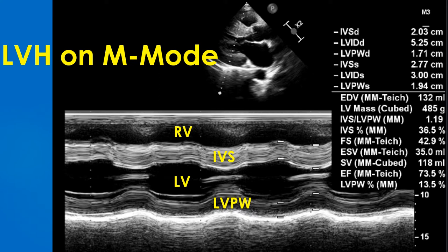M-Mode echocardiogram showing left ventricular hypertrophy. IVSD – interventricular septum diastolic measurement. LVIDD – left ventricular internal dimension diastolic. LVPWD – left ventricular posterior wall diastolic. IVSS – interventricular septum systolic. LVIDS – left ventricular internal dimension systolic.